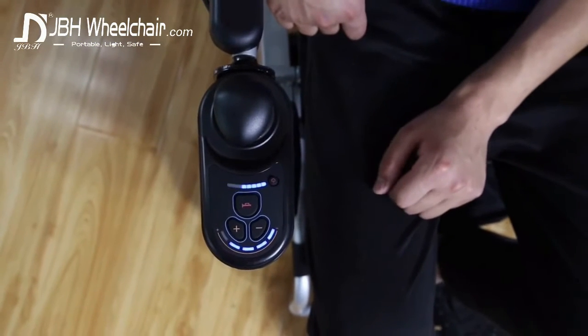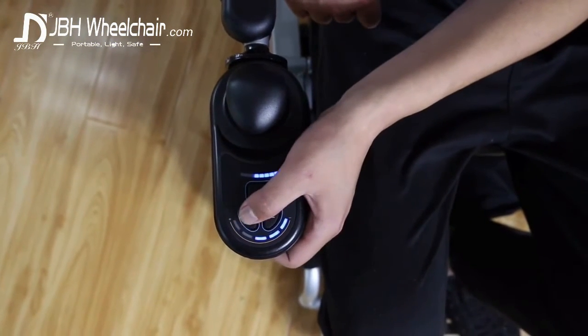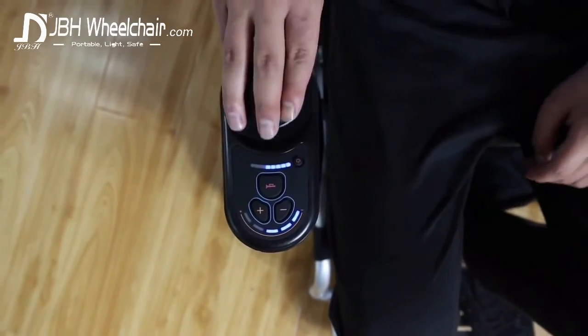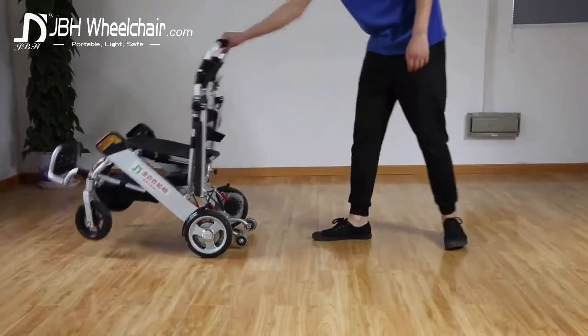The joystick panel shows you how much power you have. You can adjust your maximum speed with the touch of a button. The warning horn is also placed within easy reach. And look at how easy this chair is to fold.